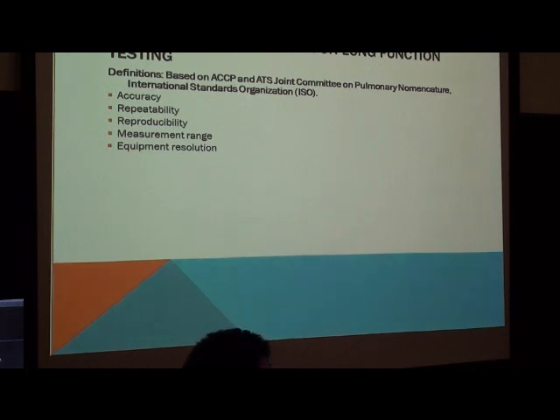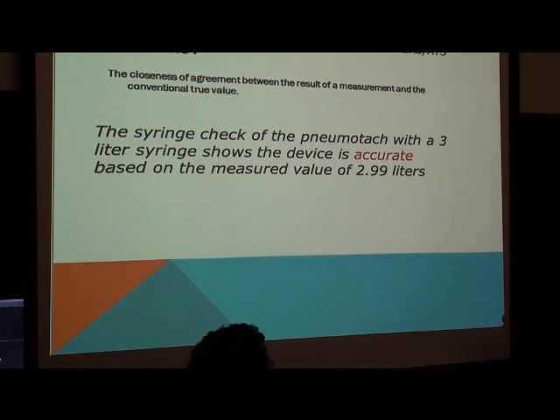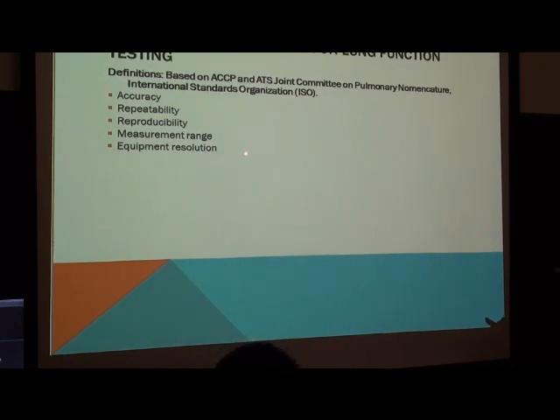So there are general considerations for lung function testing. That is a paper published by the ACCP, American College of Chest Physicians, and the ATS Joint Committee on Pulmonary Nomenclature. I just wanted to make sure that we're all speaking the same language. Boy, I keep hitting the wrong button here, folks.